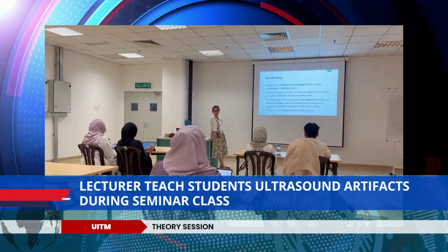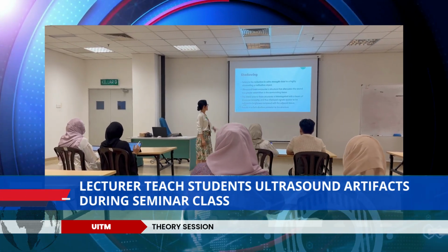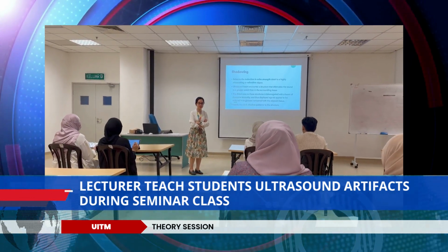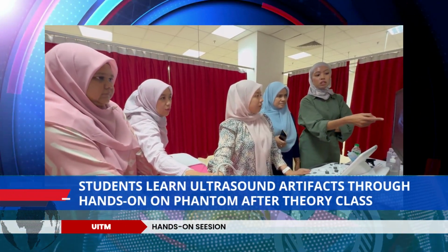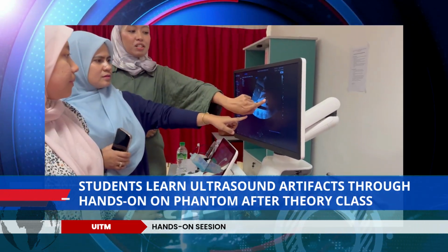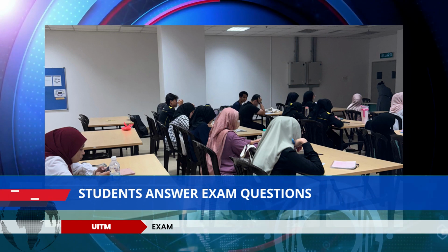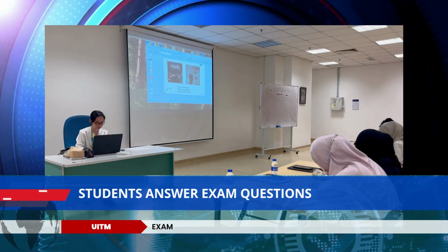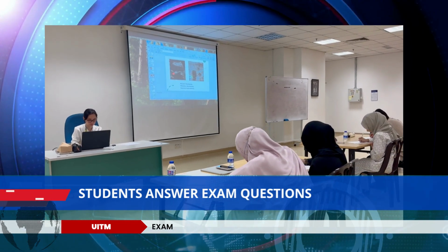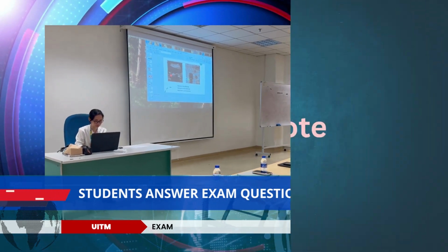In the learning method test, students were divided into two groups. One group of students learned ultrasound image artifacts theoretically in lecture class, while the other group combined lecture class with hands-on learning using the ultrasound phantom. After that, all students answered exam questions after they learned the lesson. The answers were marked by the lecturer in charge of the course MRD 535 Ultrasound Physics and Instrumentation.